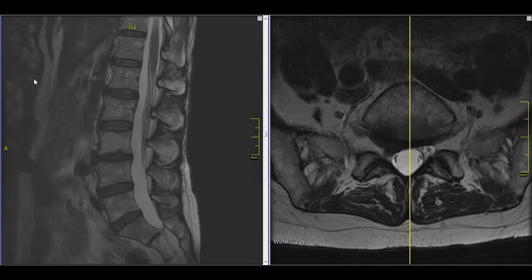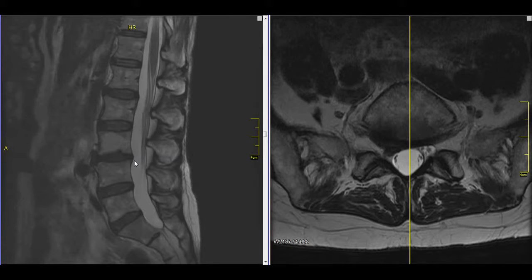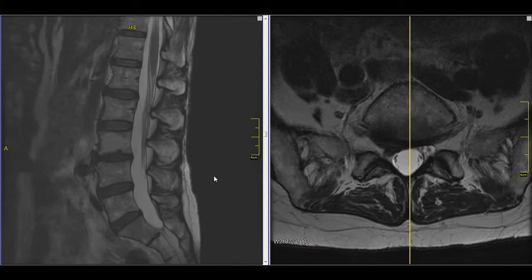Dr. Johnson here again. Today we're going to be looking at an MRI scan of the lumbar spine that is abnormal. This one shows a herniated disc, or a displaced disc, causing leg pain. We're going to go through that the way we did with the normal MRI scans in the other videos in this series.